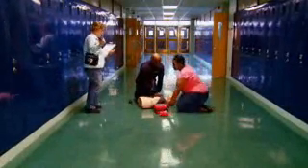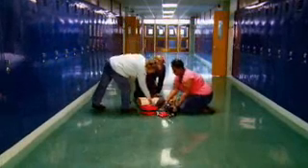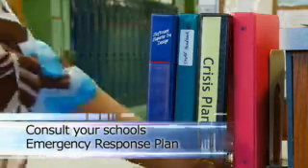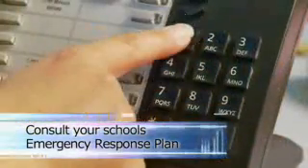You may see some involuntary muscle movement or gasping. Do not mistake this for a response. Consult your school's emergency response plan to confirm the proper procedure for connecting to your EMS. Your school emergency response plan should also include specific agreed-upon wording for public address announcements used in activating the response team. "This is a drill."